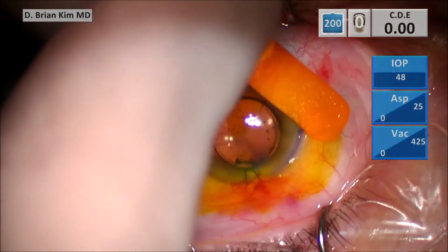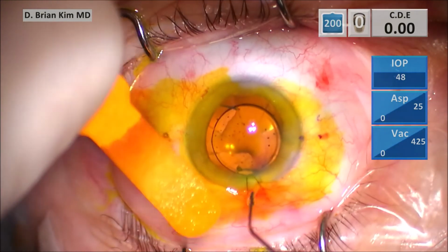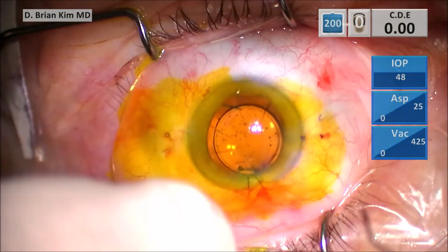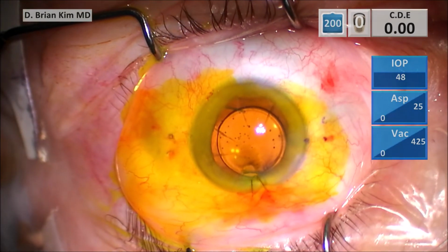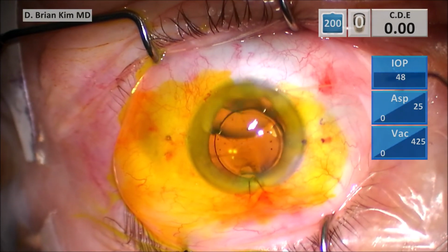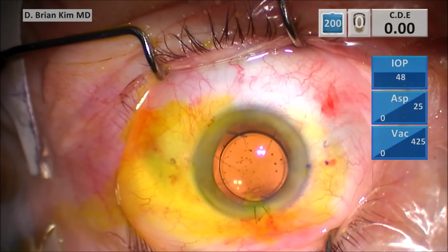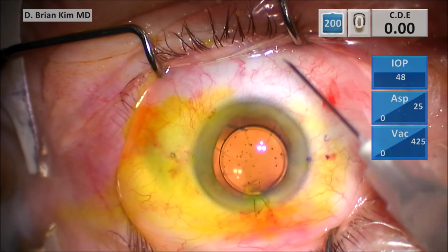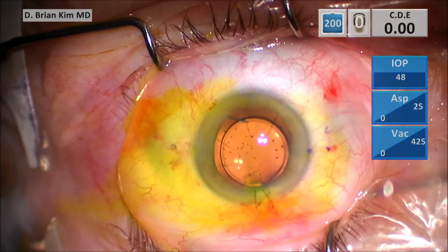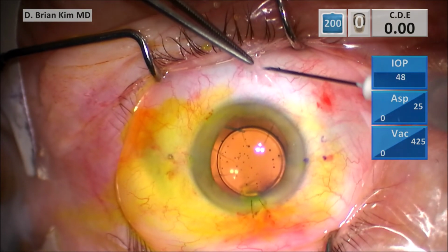And then I performed my modified Yamane technique, externalizing the leading haptic using a 25 gauge docking technique through a contralateral limbal incision. Thereby, I'm able to move the entire lens away from me because the leading haptic is outside of the eye. I'm able to access the trailing haptic much more effectively. And again, 30 gauge thin walled needles. We're using the Sensar lens, very delicate holding of the haptic so I can cannulate the needle on the right side and then the left side, pulling the needles out.